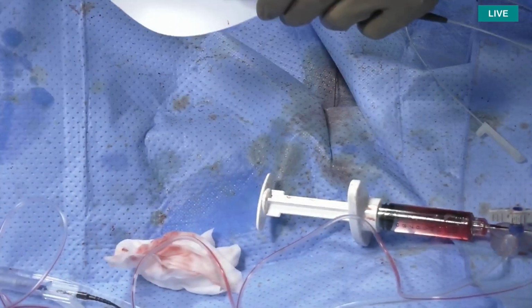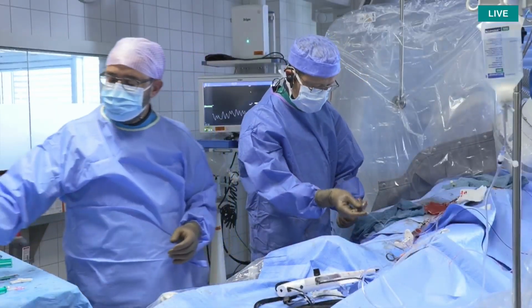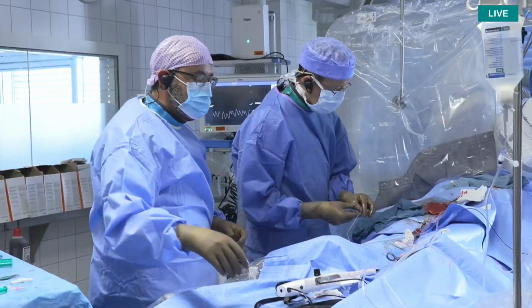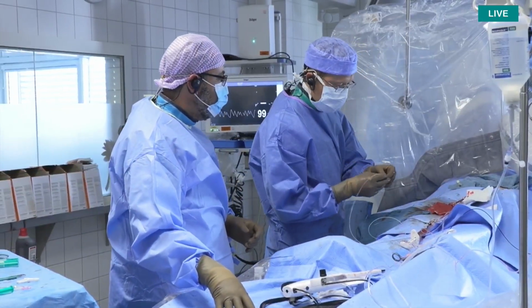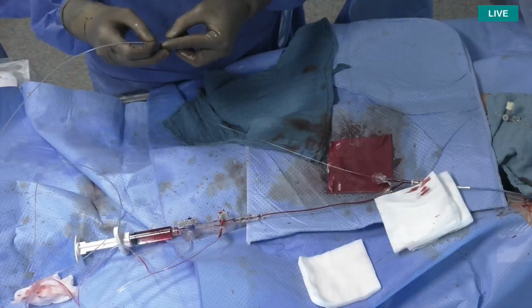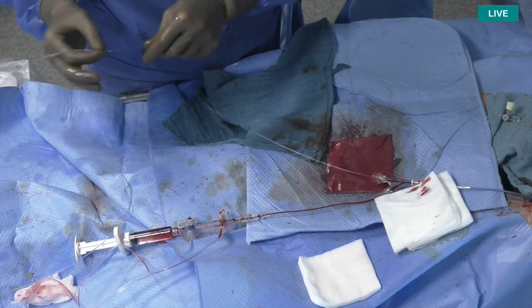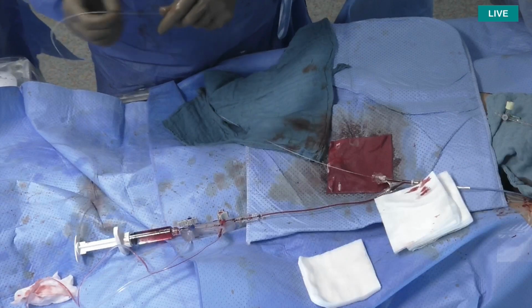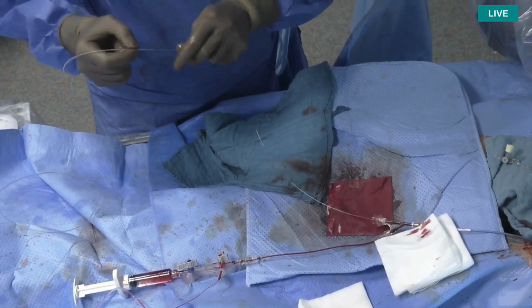So that's it. How often do you use two burrs when you are doing a rotablator? Yes, it's also a good question. There is a scientific and a clinical answer to it. So the scientific answer, if you look at the randomized studies, almost 85% of cases were done using one burr, and the need for a second burr was around 10 to 15%.